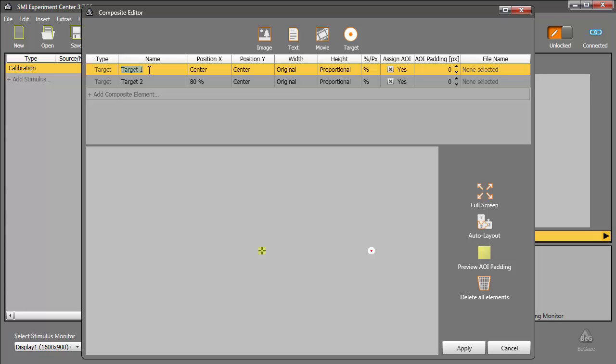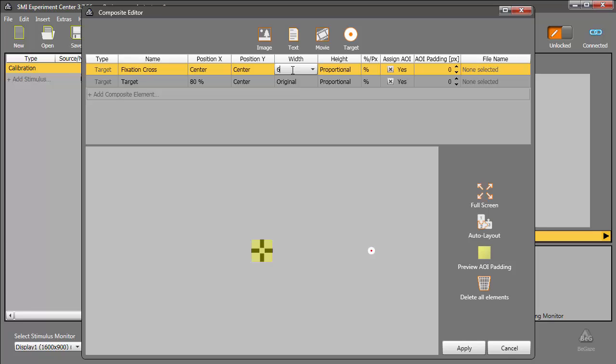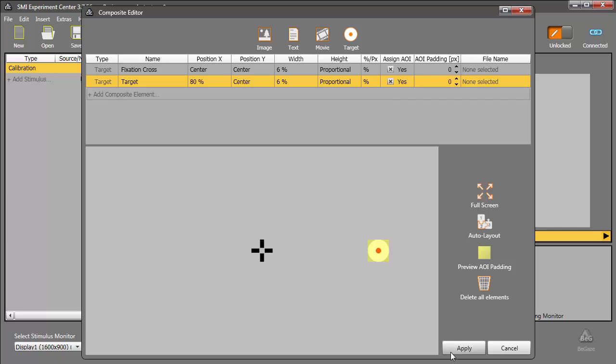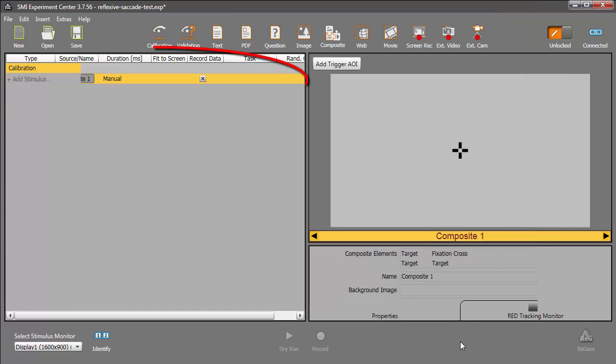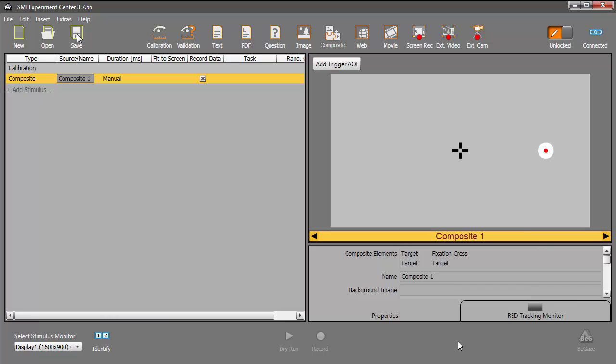For example, let's customize the names to identify them better. I'll label the first one Fixation Cross, and the second just Target. Furthermore, I can specify the width for both. Let's make them each 6%. I'm ready to apply my changes in the composite editor. And once I do that, you'll see the composite stimulus. Let's set the overall duration to 3 seconds, 3000 milliseconds.